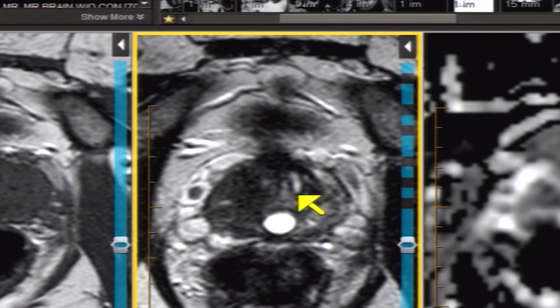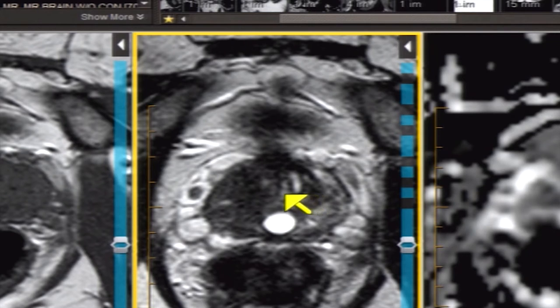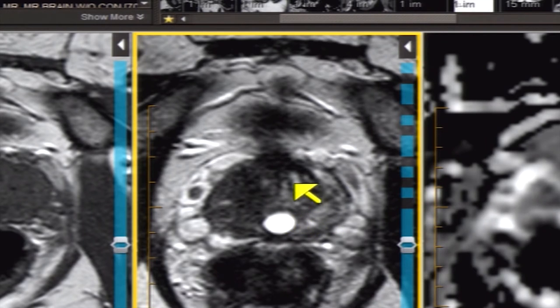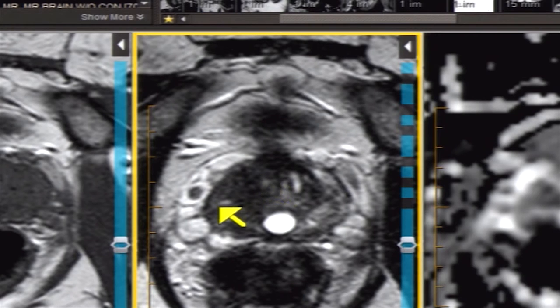Here's our introductory case: a 63-year-old man who has an incidental PSA of over 40 at a health fair, then goes to see his physician with an abnormal examination and an abnormal MRI. On the right side of the gland, there is diffuse intermediate signal intensity showing the charcoal or erasure sign.